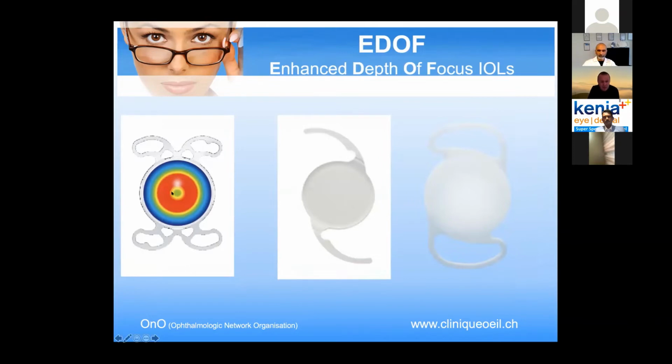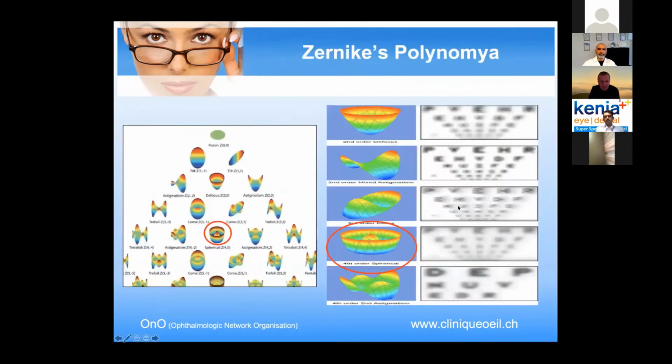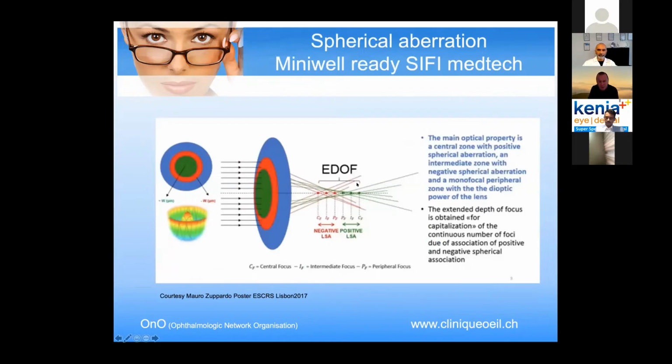So here you have the aberration, that's a Symphony, and that's a Lucidis. You have to remember, for people who do a lot of refractive surgery for presbyopia, you use the 4th order of spherical aberration, and it's exactly one of the EDOF systems. It's interesting to know that what we do on the cornea, we can do on a lens, and you will have an EDOF lens, where you induce spherical aberration number 4, and you have a different type of distance. We used that for a long time with presby LASIK. It's working pretty well, but not as well as we want. There is a lot of correction after that. We have to speak with the patient, and there are a lot of blurs. That's the first EDOF.